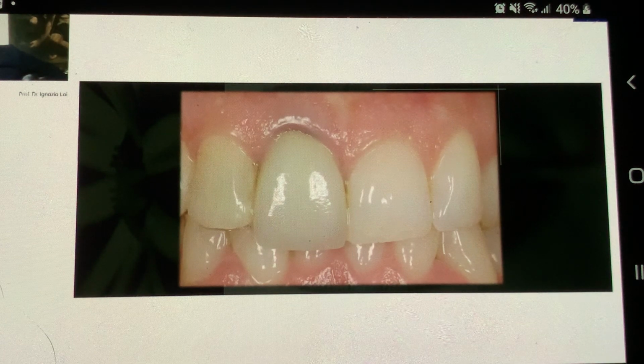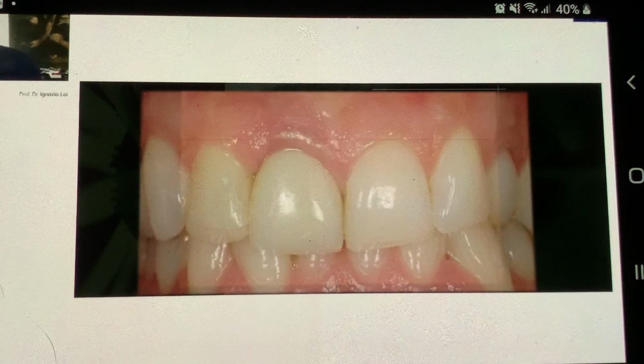But if I eliminate the finish line and I create a vertical wall, through the provisional teeth, I can reposition towards the coronal part the new prosthetic CEJ, so that the tissue will thicken and grow towards the lower part. And this is important from a therapeutical point of view. We can treat many cases which usually were treated with resective surgery.